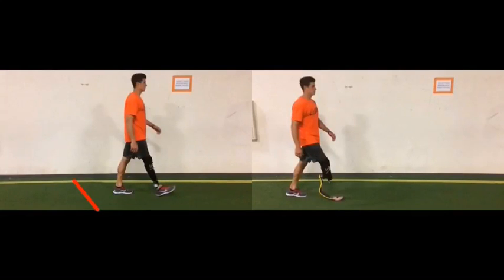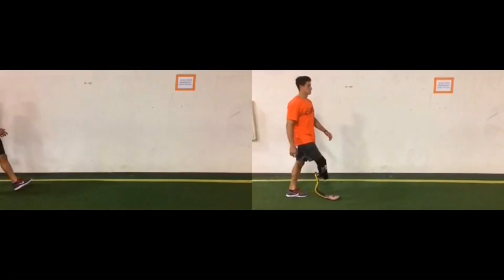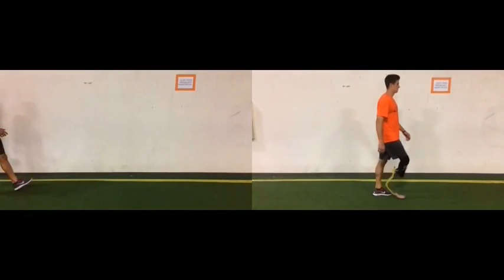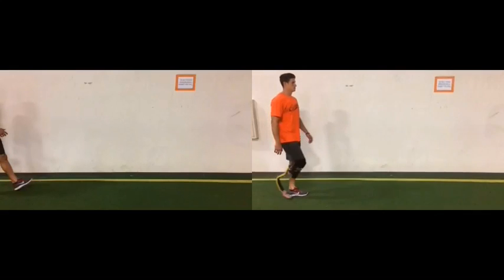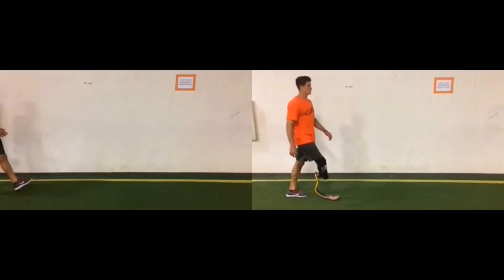Whereas the sprinting prosthetic, the foot is going to remain plantar flexed the whole time. The foot is made just for top end speed sprinting, and so there's no need to have dorsiflexion and no need to load any heel or anything like that. We can also see that because of the plantar flexion in the sprinting prosthetic, there is minimal knee extension. Let's go ahead and watch this.